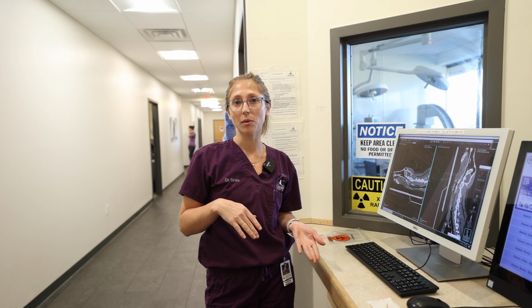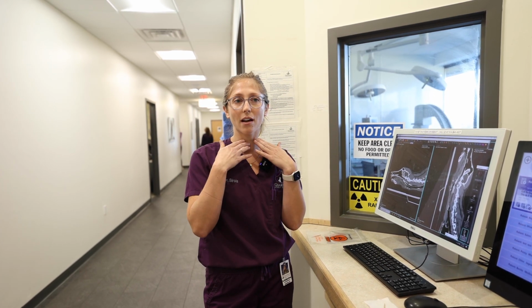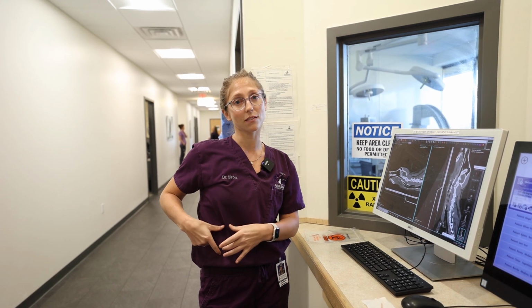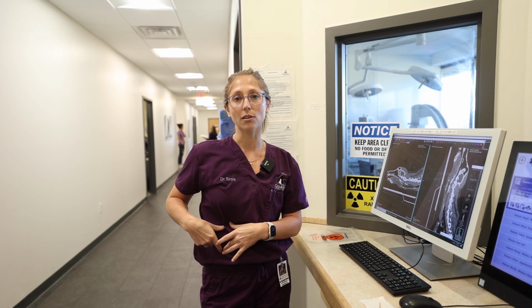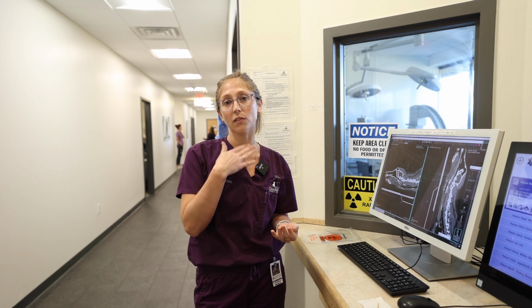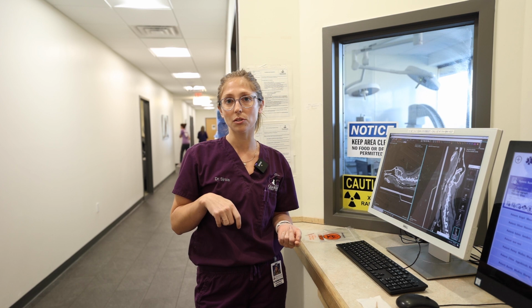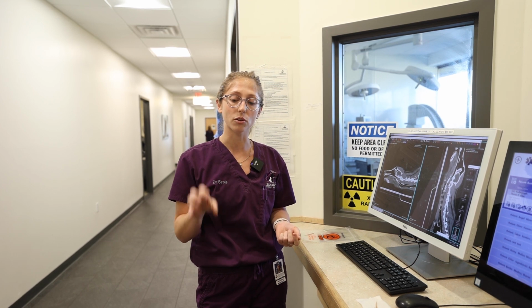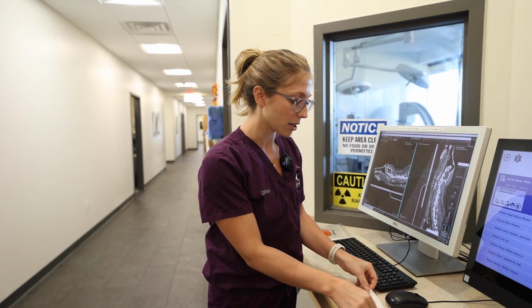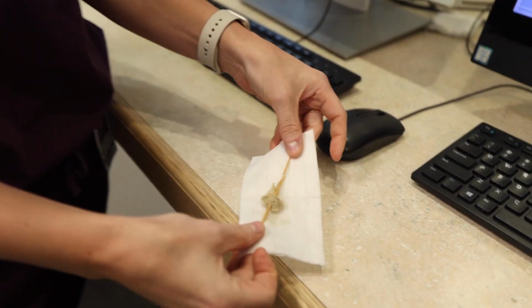When she came into the hospital, we took some x-rays of her neck area and her stomach, and we could see some pretty severe swelling at the base of her tongue, as well as a piece of the toothpick in her stomach. So we initially went ahead and did a CT scan to get a better look at the swelling in her neck. And then following the CT scan, we popped down into her stomach with a camera and a little grasping instrument in order to pull out the first toothpick, which was present in its entirety. So we knew we had the whole thing there.